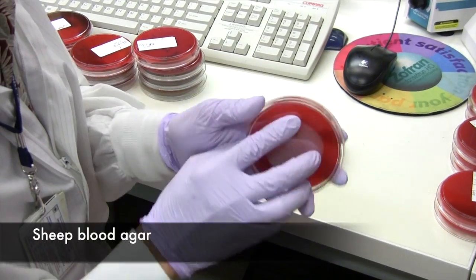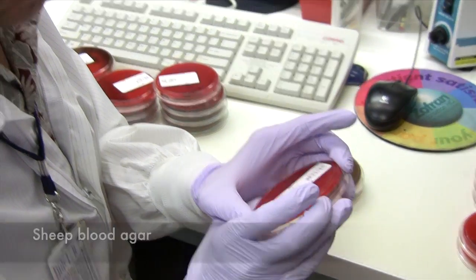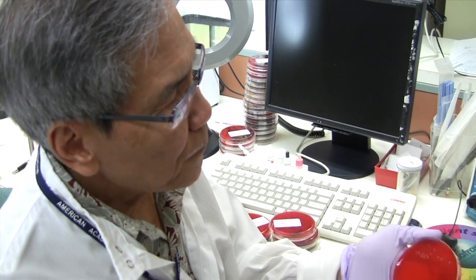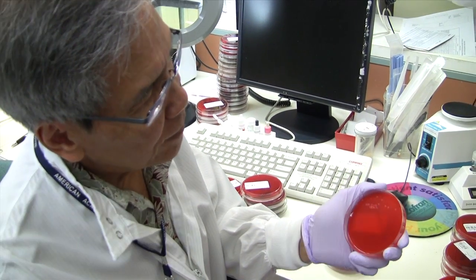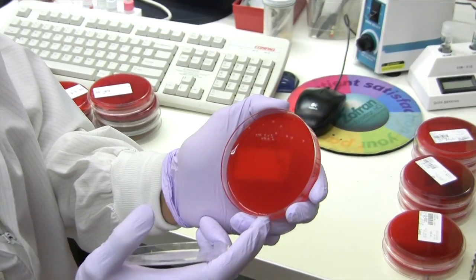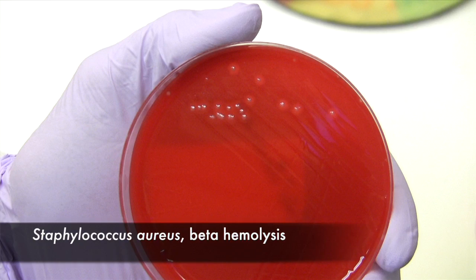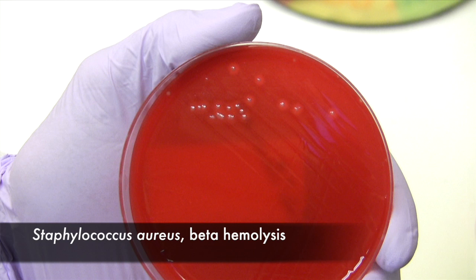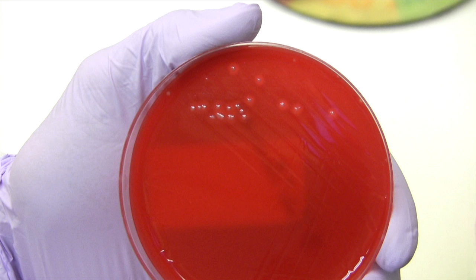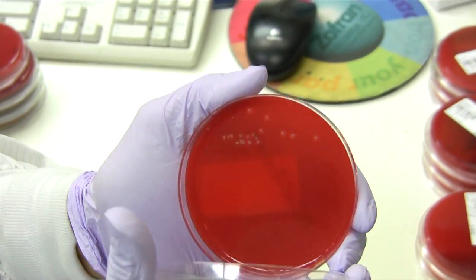First, we have the blood agar plate, which is composed of sheep blood and tryptic soy agar. Here you can see the usual isolate that we're finding in wounds — staph aureus. This is a very typical picture of staph aureus. This is how staph aureus looks like on a blood agar plate.